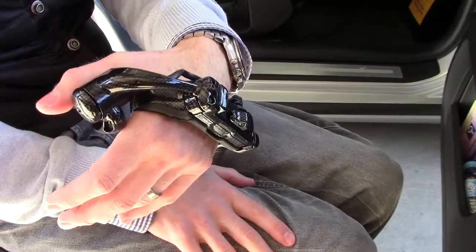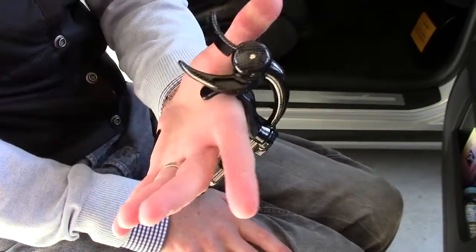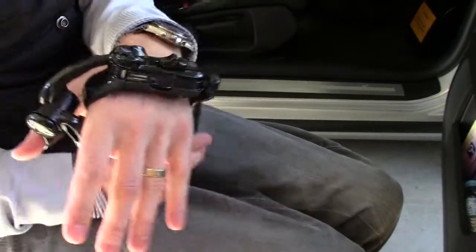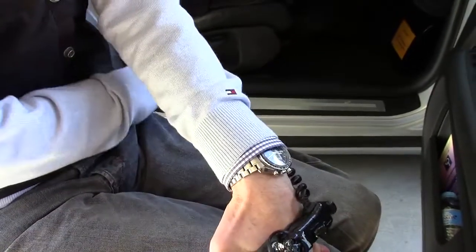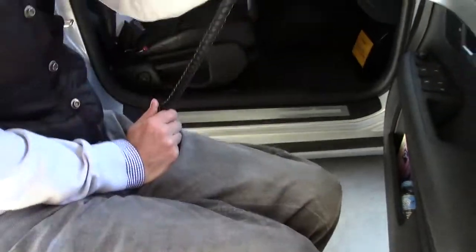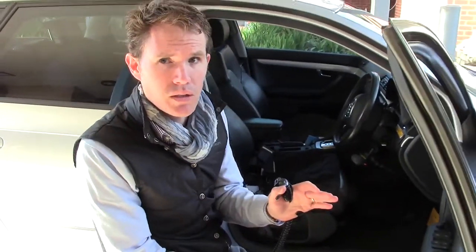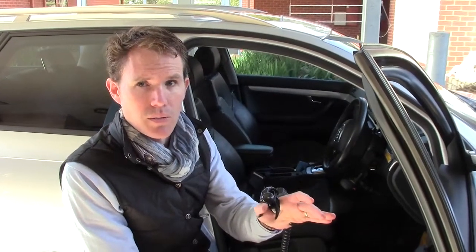Here we have the Fadiol corded satellite accelerator. The functionality is identical to the cordless unit; however, we have the cord. The cord is always mounted back so it never gets in the way of the steering. With this, I can still do palming, hand over hand, and push-pull technique — all three steering techniques unencumbered, while at the same time providing precise acceleration.